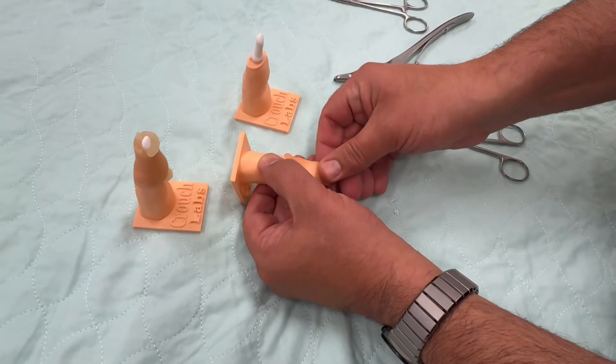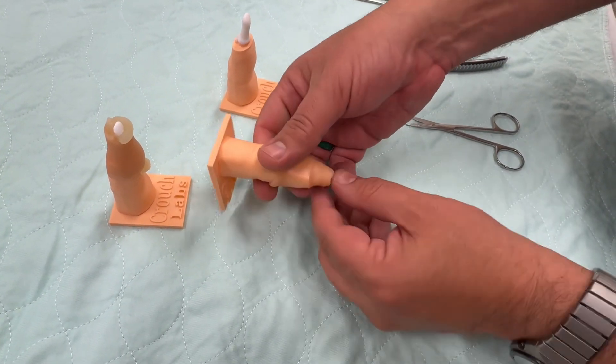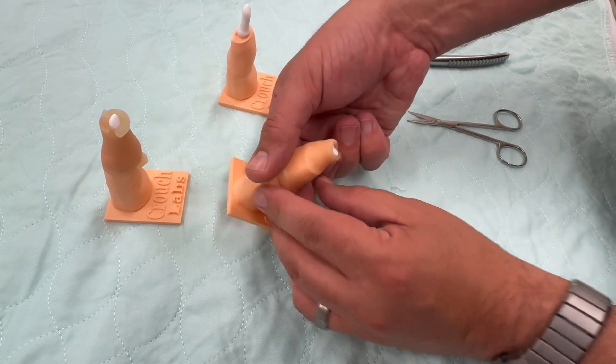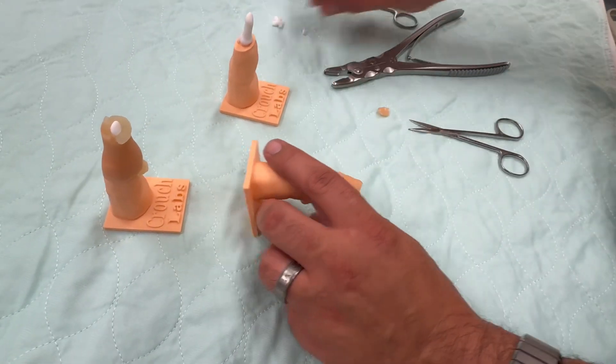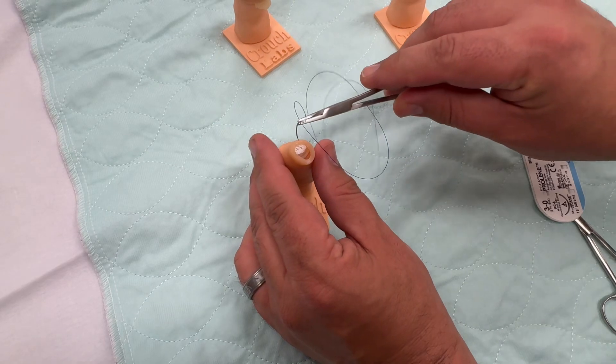Once you've used the rongeur to grind back the bone to the point where the soft tissues can be covered, you can practice different techniques for closure. One of the fun things about this model is that after you've placed your sutures you can take them out and do multiple attempts.